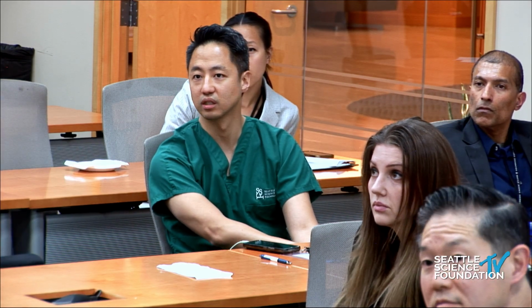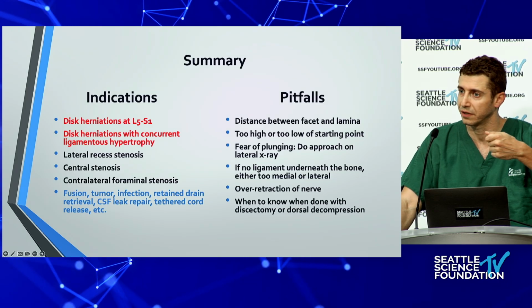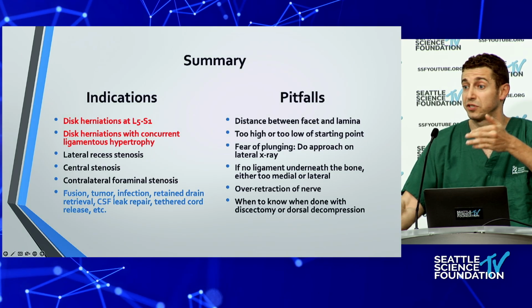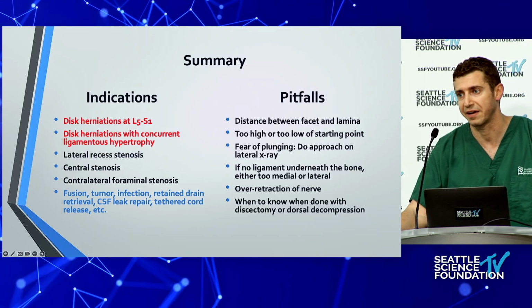Yeah, no, I agree. The one thing is, there are some people that put in a second port, because if you put in a second port, you could sew it. So that would be something to think about. Let's say if it's a humongous tear and it's just spaghetti, that's a different story. Thankfully, I haven't had that happen yet.